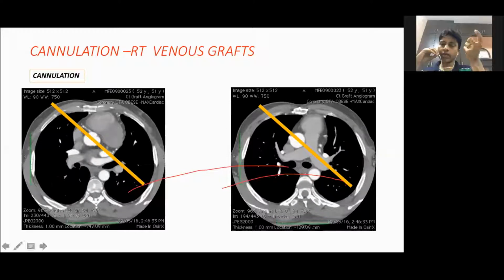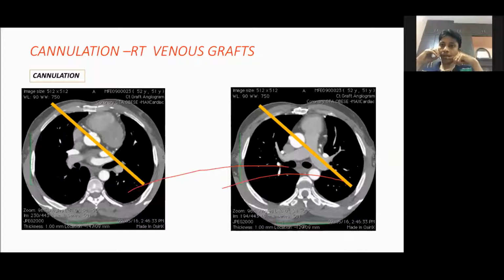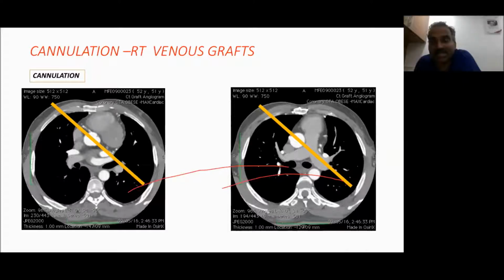And if at all stenting is required, if there is a discrepancy between the size of the distal and proximal vessels, which size do you generally take? Obviously the size is the distal size. Distal size, and try to end as close to the lesion as possible.